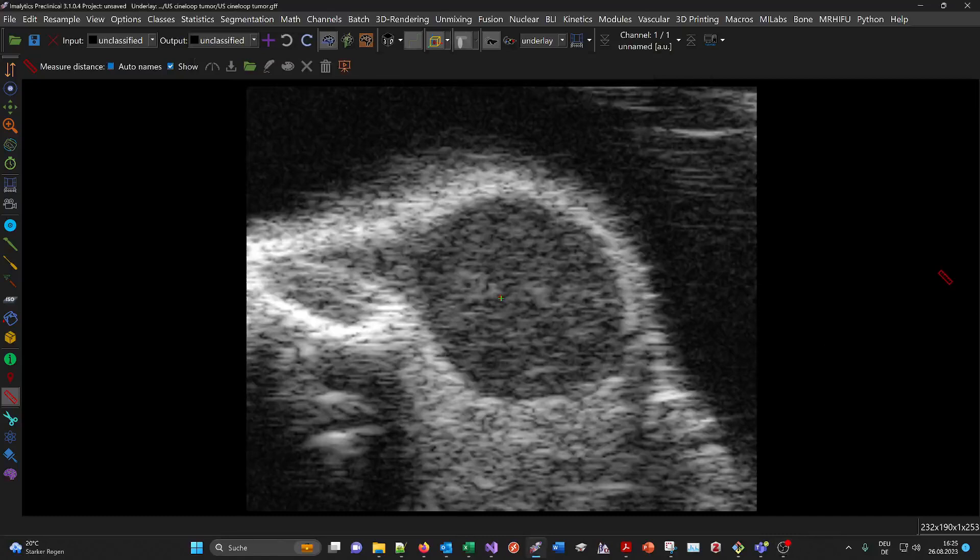Hello, welcome to this video. Today I'll show you an ultrasound cine-loop scan of a mouse tumor.